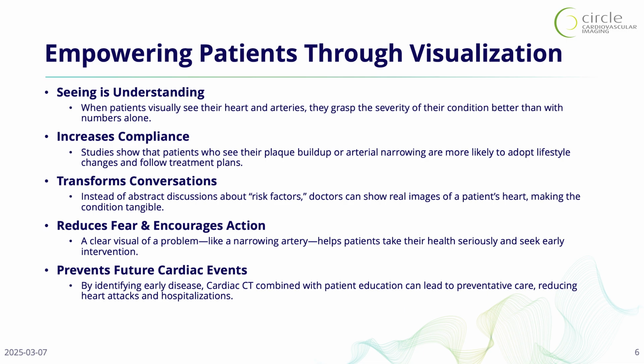And then obviously, as you've heard about all day today, CT for reducing future cardiac events. It's the only imaging modality where in several studies, the primary outcome measure is not diagnostic accuracy. The primary outcome measure is reducing MACE events. Show me a stress test that uses that as a primary outcome measure. So I think using Circle as a vehicle for showing those images, helping patients understand, because showing a raw DICOM image off of a PACS system is not very intuitive.